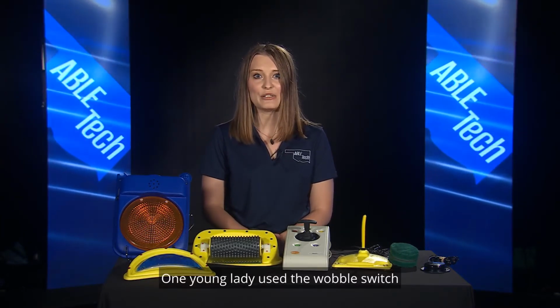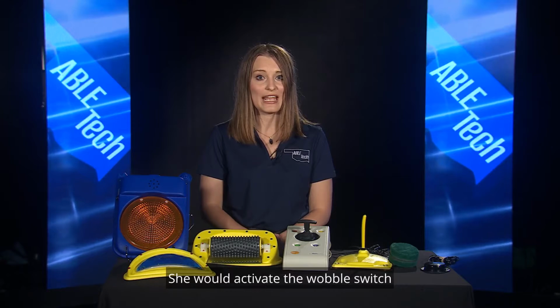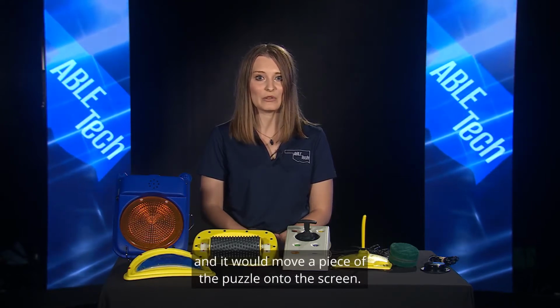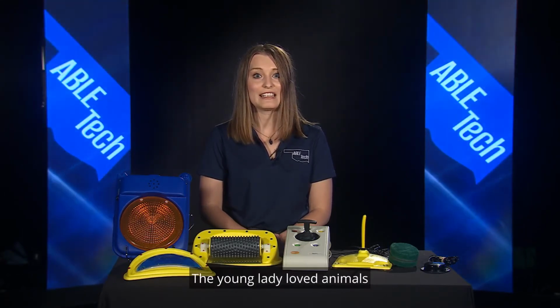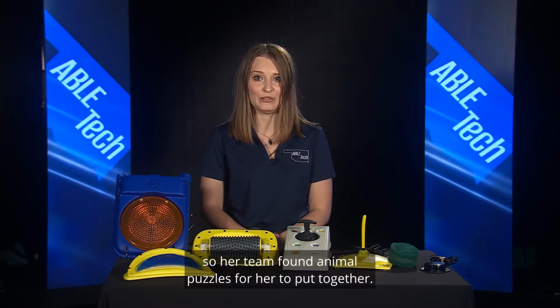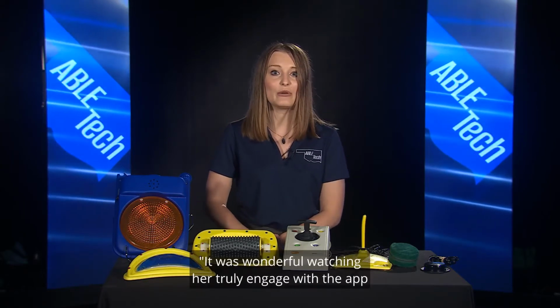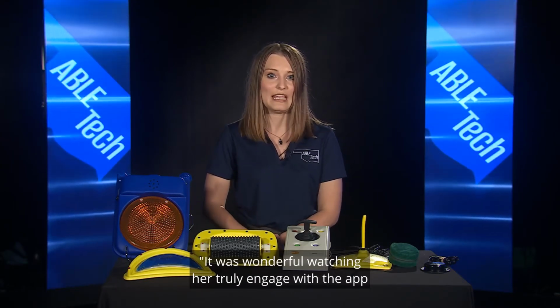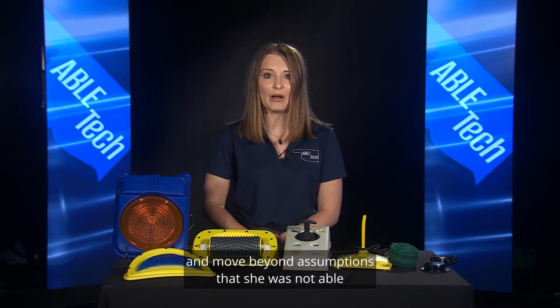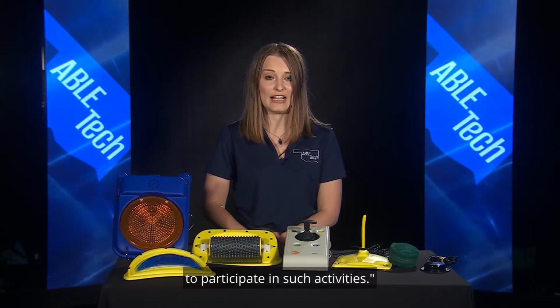One young lady used the wobble switch to access and use a puzzle app. She would activate the wobble switch and it would move a piece of the puzzle onto the screen. The young lady loved animals, so her team found animal puzzles for her to put together. She loved it. Her teacher shared it was wonderful watching her truly engage with the app and move beyond assumptions that she was not able to participate in such activities.